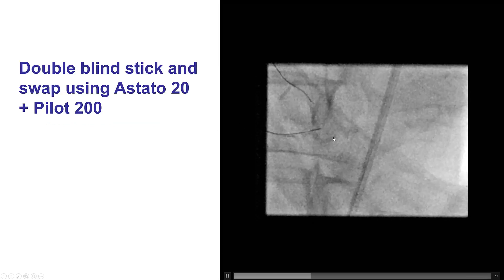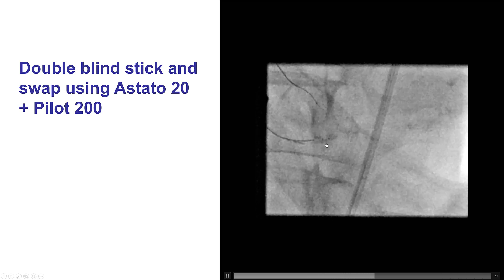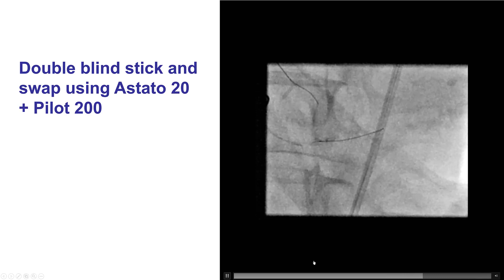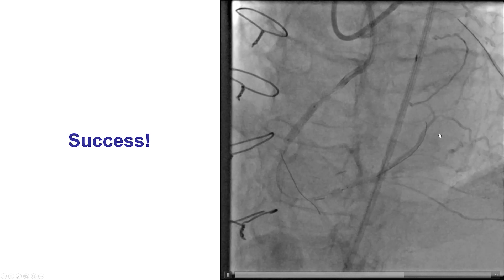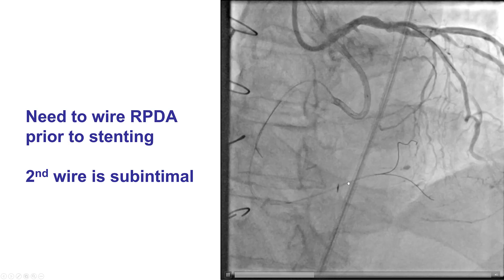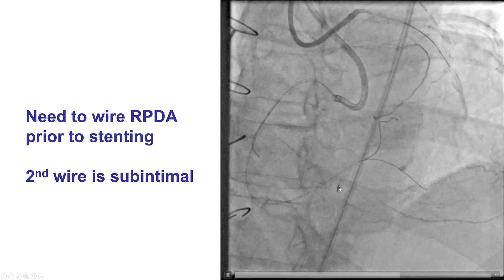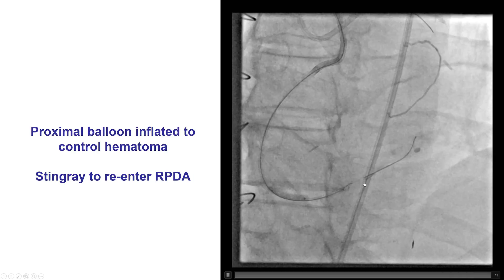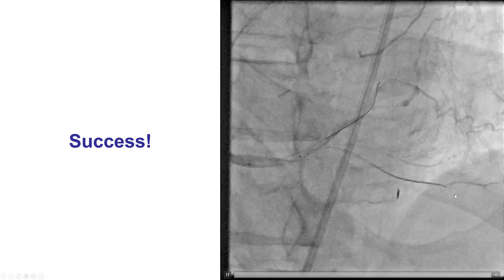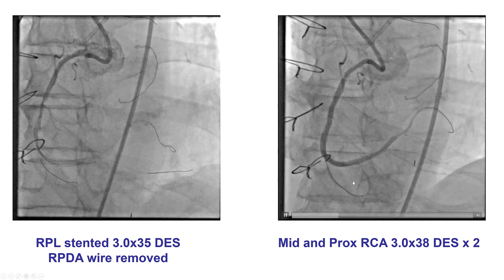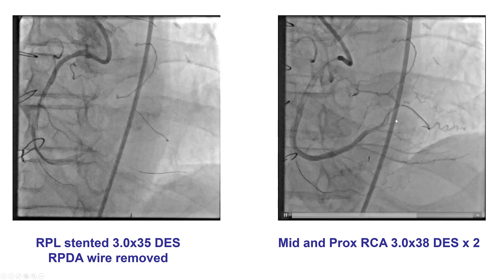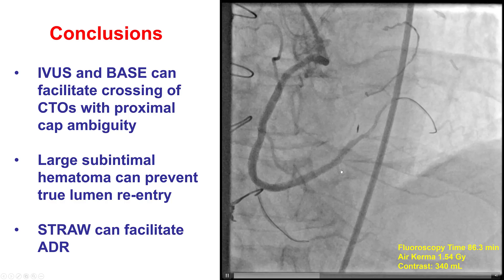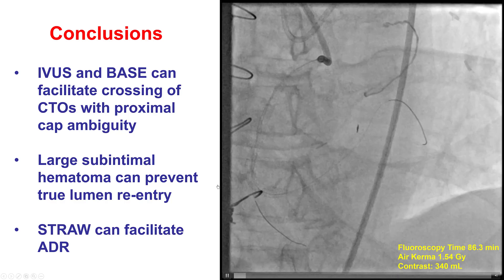An Astato 20 stiff 20-gram guide wire was advanced through the side port of the stingray balloon and seemed to advance along the course of the vessel. Contralateral injection demonstrated that the wire seemed to be going in the right direction. We did not want to affect the patency of the PDA, so we made another attempt to wire the PDA using the stingray balloon at the origin of the PDA, and we were then able to successfully wire into the PDA as well, which ended up being a fairly small branch. We then placed stents in the right coronary artery from distal to proximal, restoring good antegrade TIMI flow.